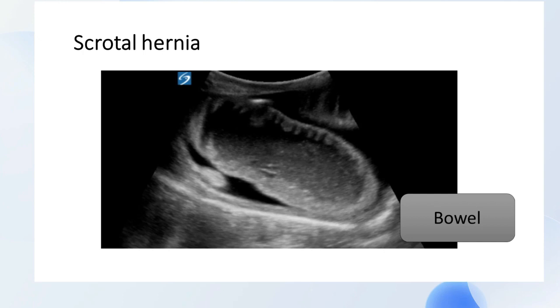So this is bowel hernia, inguinal hernia. At times, omentum or fat can also prolapse via the inguinal canal. When that happens, we can call that an omental hernia, prolapsing also into the inguinal canal, and it also can affect the scrotum.